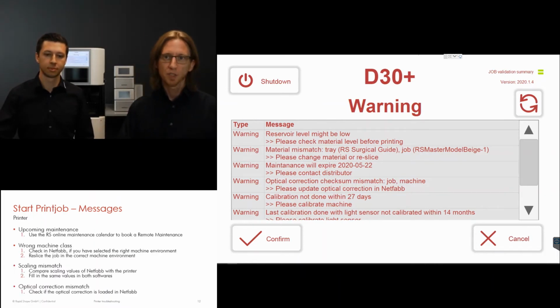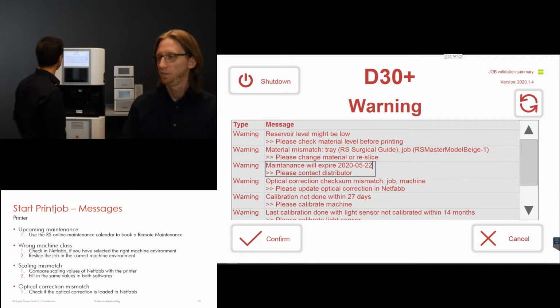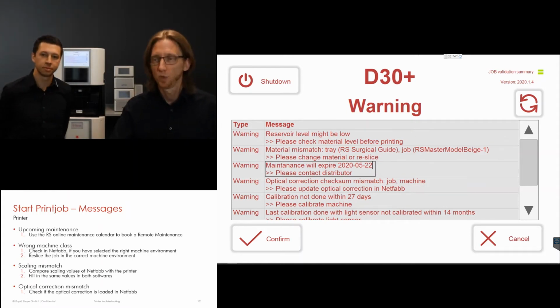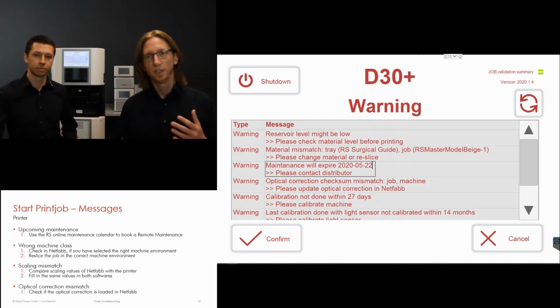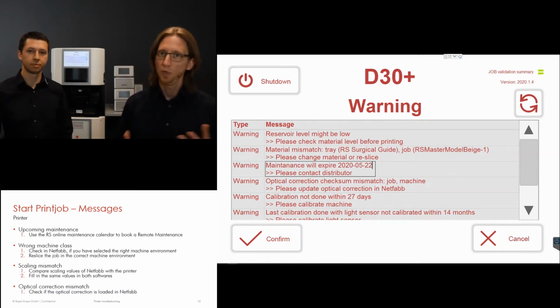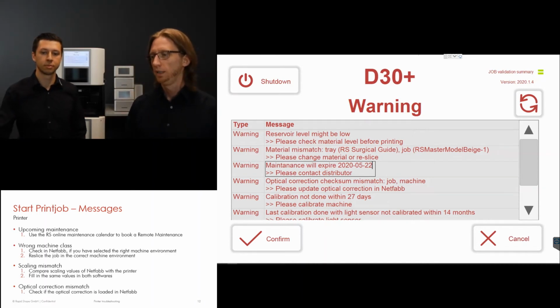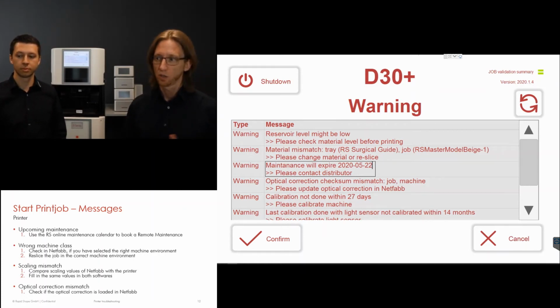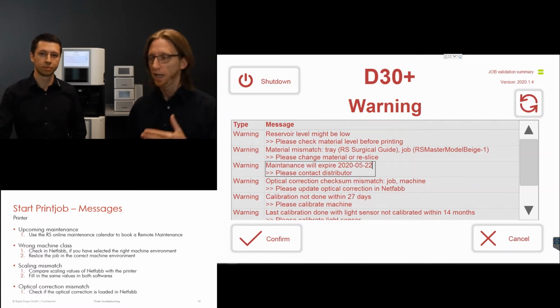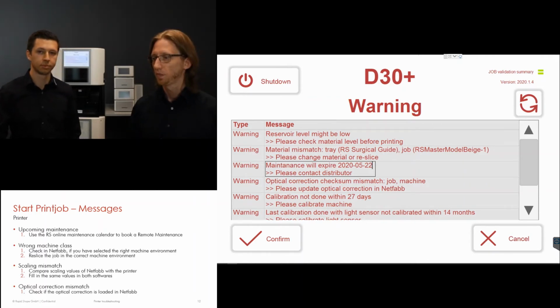All right, so let me start with the first one. Maybe you can highlight this on the screen, Robin, that would be great. You said it's the maintenance. As you can see, we have something called maintenance will expire. In this case, it shows us also the date, and we have the information, please contact the distributor. What that means is that after a year, the machine will need to have a maintenance. Could be a remote maintenance or an on-site maintenance. It depends on the maintenance contract the customer has with us. Well, and then the machine gives you a heads up a month before the actual maintenance date. So 4 weeks before the maintenance will expire, every time you start a job, you get this message on the screen.